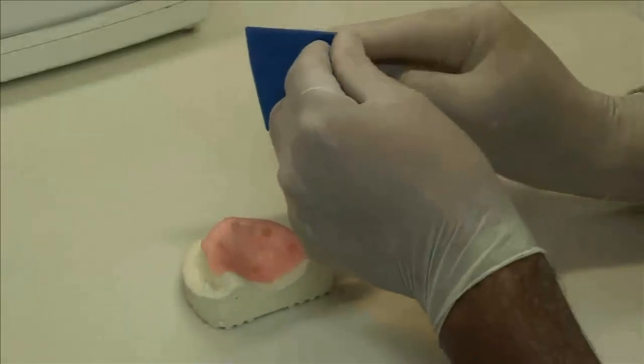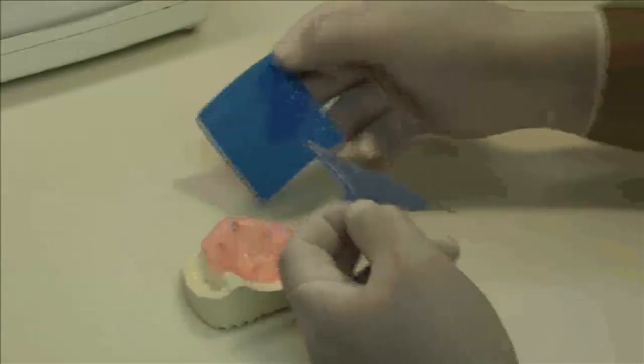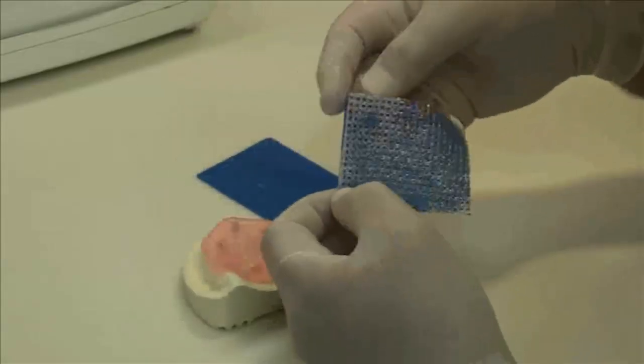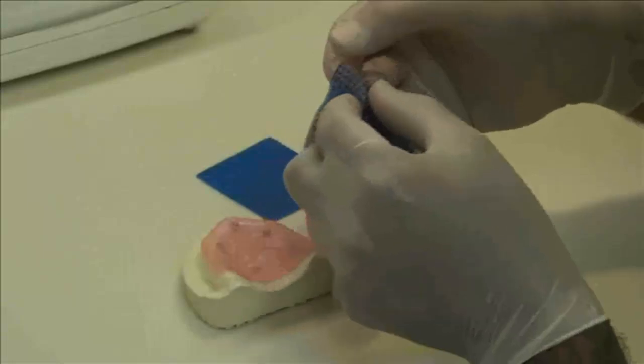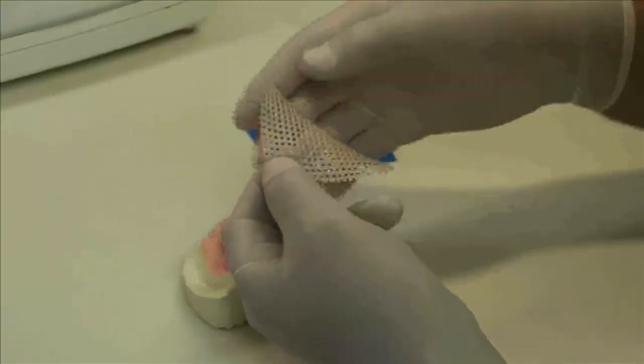Remove the plastic cover and position the FiberForce mesh onto the model. It's not necessary to adapt the mesh closely to the model at this time. This will be accomplished using the splint vac unit in the next stage of the process.